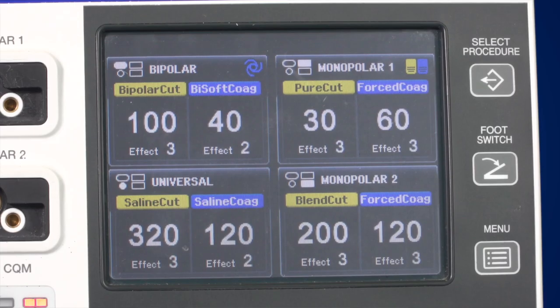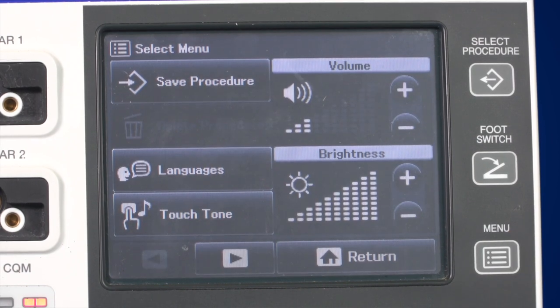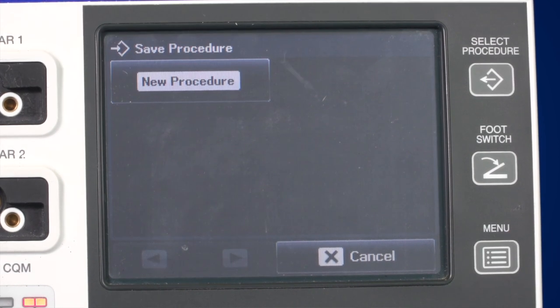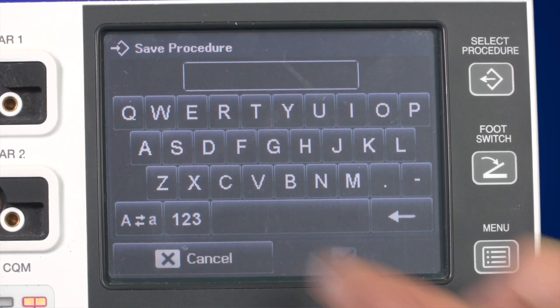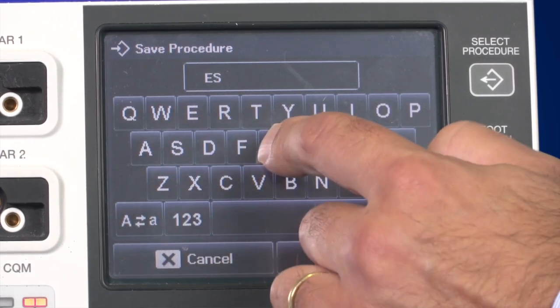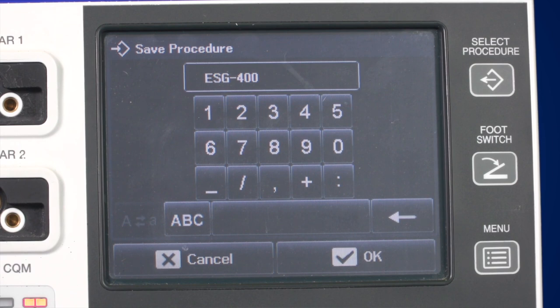When referencing the buttons on the right side of the ESG400, the upper button is the Select Procedure button — it allows you to select your personalised procedure settings. To save your procedure settings, press the lower Menu button, then select Save Procedure. You can either override a previously saved procedure or create a new procedure by adding a new name to the list. Complete the process by pressing the OK button.